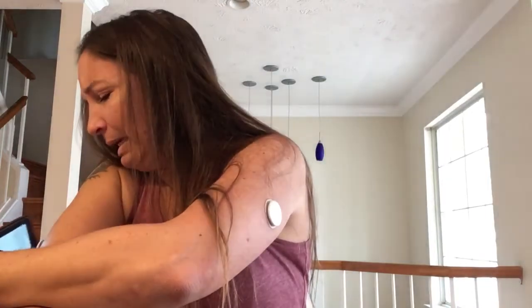Okay, starting a new sensor will end the sensor you're currently using. Would you like to start the new one now? I'm going to hit yes. And then it says start new sensor, scan sensor to start it. Okay, so it's done. New sensor starting up. Sensor can be used in 60 minutes. Okay, so, and I got blood on my hands.